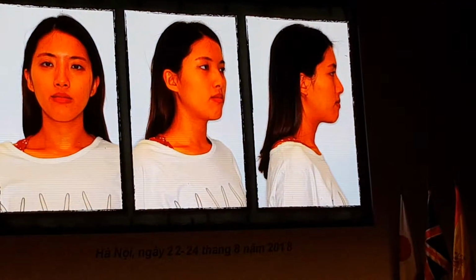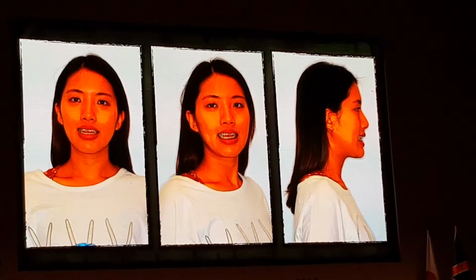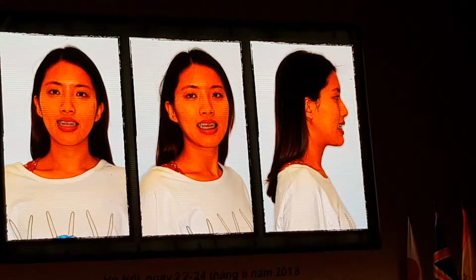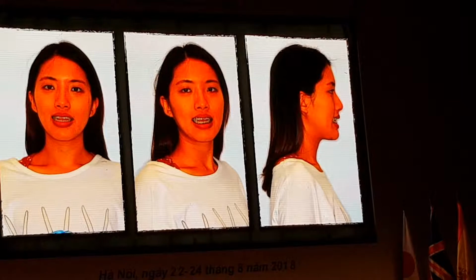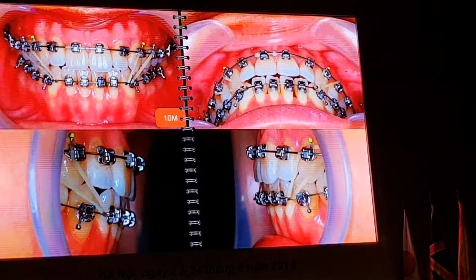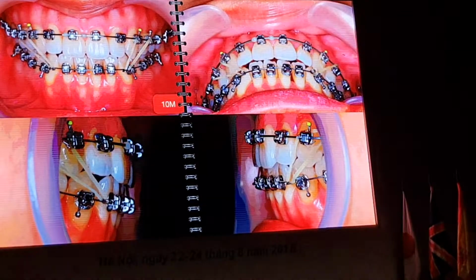So here is when we just start to correct her Openbite. You can see when the patient smiles, she's still very open. But she is very good at brushing and elastic. So look at what happened after 3 months. This is actually very effective when you want to change lower functional occlusal plane.